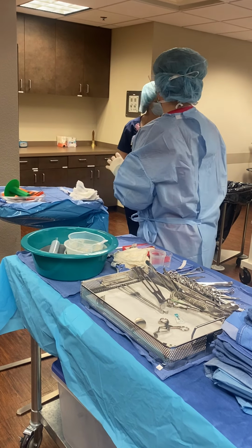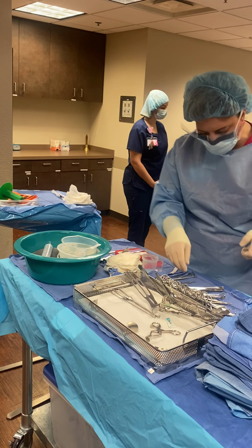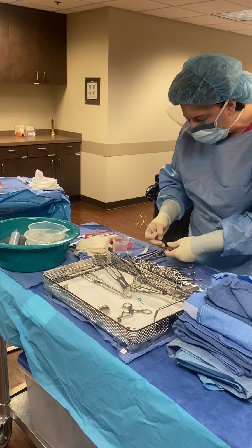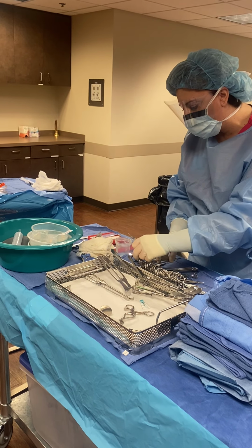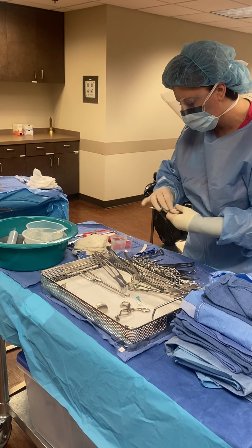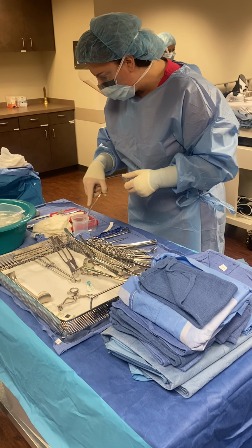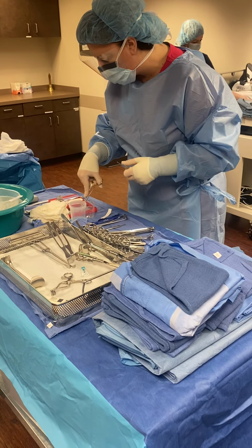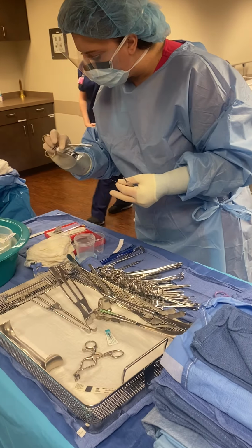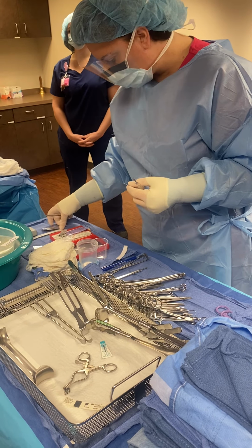Okay, let's see. We have everything, right? We're good. So I'm going to load my scalpel. To do that, you need a scalpel handle and a needle holder. Best to use one that's a little more hefty than the Webster, just so you don't hurt him. Typically for a case like this, the surgeon is going to use a 15 blade. Do I have two 15 blades? Yeah, so I'm going to load up. Do you want a 15 blade? Okay.